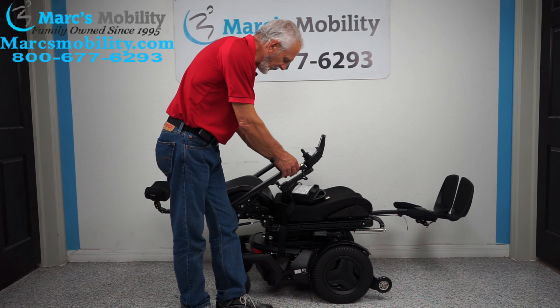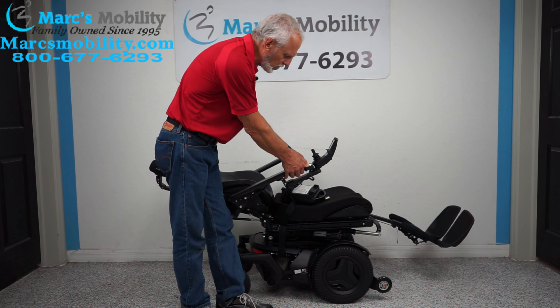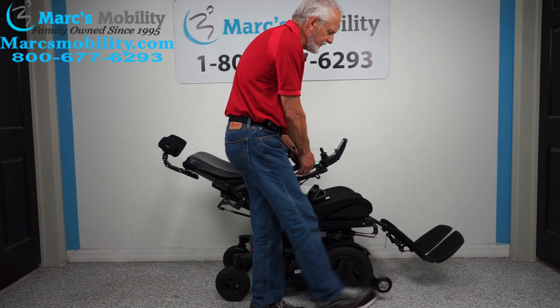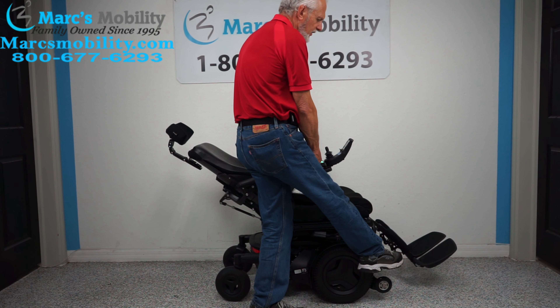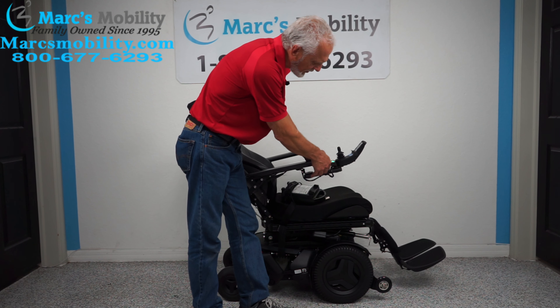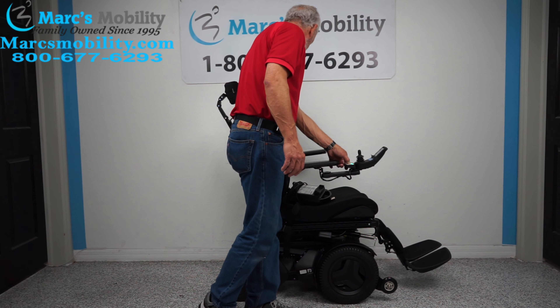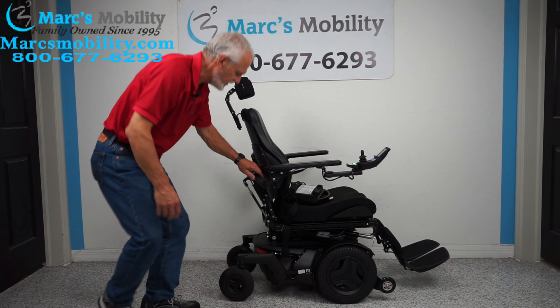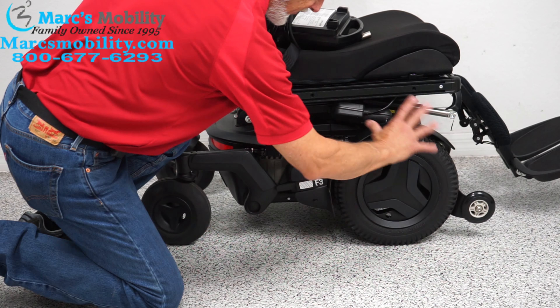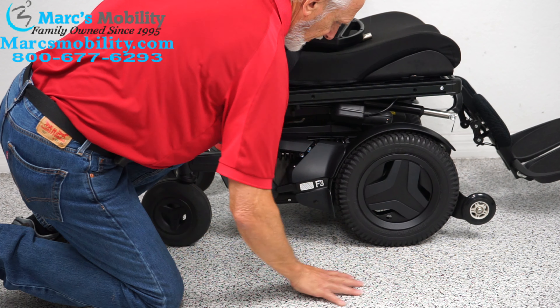I'm going to bring the recline back up and the legs back down, doing two buttons at once to save time. If you're outside, leave your legs out a little bit so you have more clearance. This chair has three electrical functions, seven miles, front wheel drive — which means it's really good for outside, because all the weight of the chair is transferred to this wheel, so you have good traction.